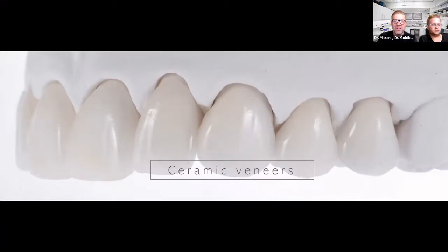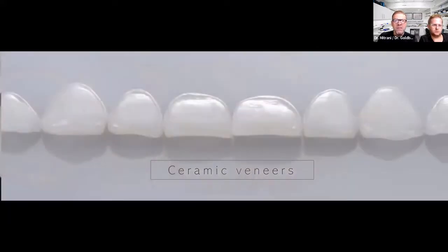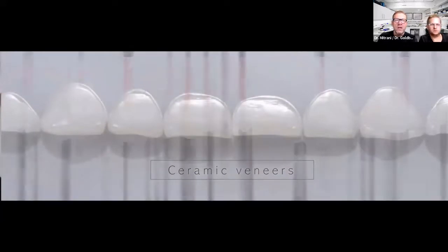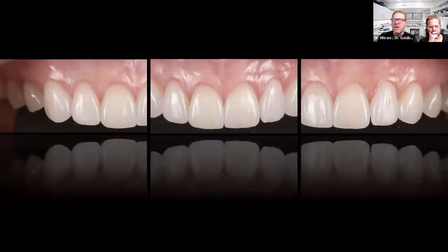So here we do our preliminary provisionalization, and here you can see now the ceramic veneers fabricated by one of our very talented technicians here, Mr. Eladio Gonzalez. And here are some different aspects of these beautiful veneers. You'll notice how he works with the line angles. Another final aspect here of the veneers in a crystal slab prior to bonding. So we try them in, and here you can see how we've enhanced the contours, but how we've stayed pretty much in the realm of minimally invasive. We're still in enamel in most of these preps, which is, again, one of the tremendous advantages that we're able to continue having by utilizing our laser units.